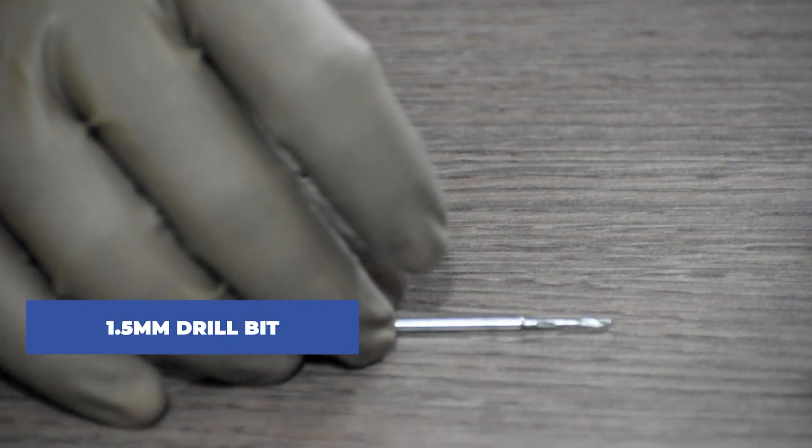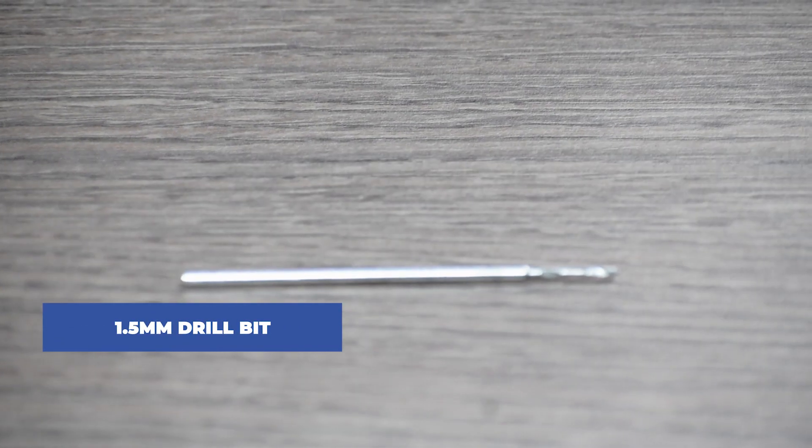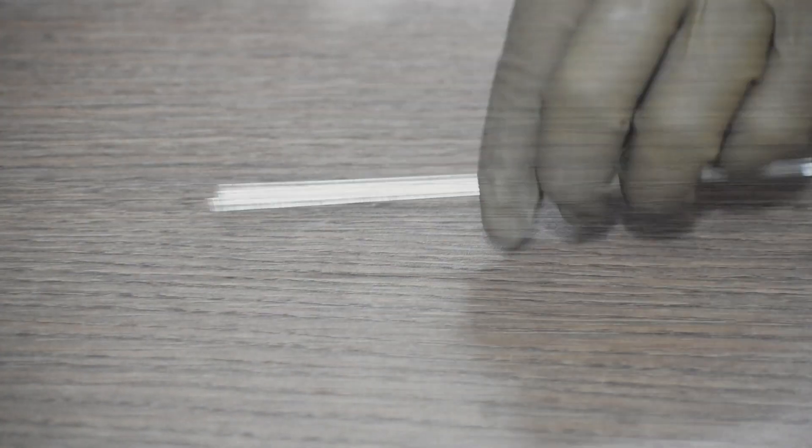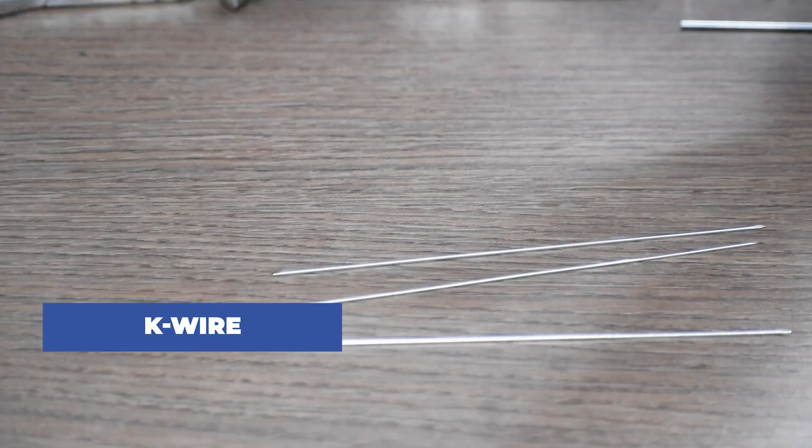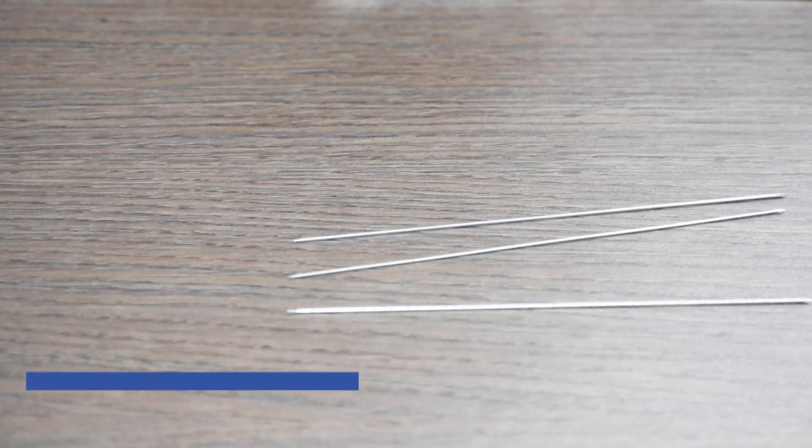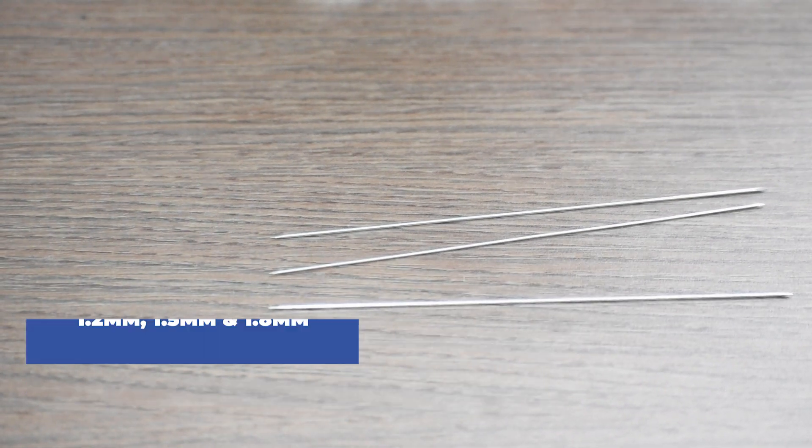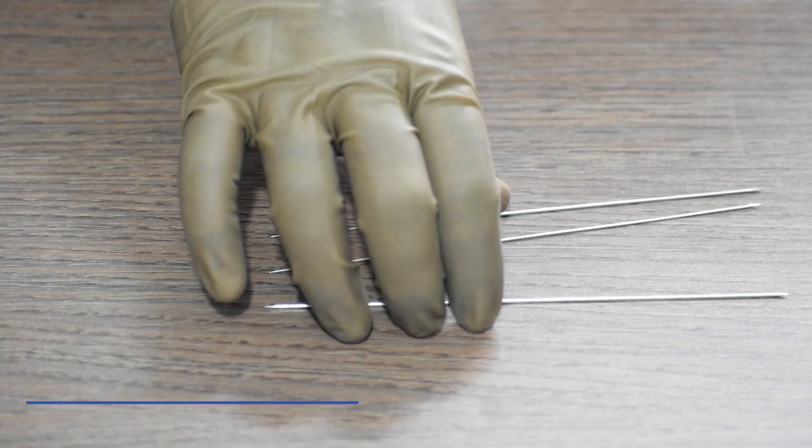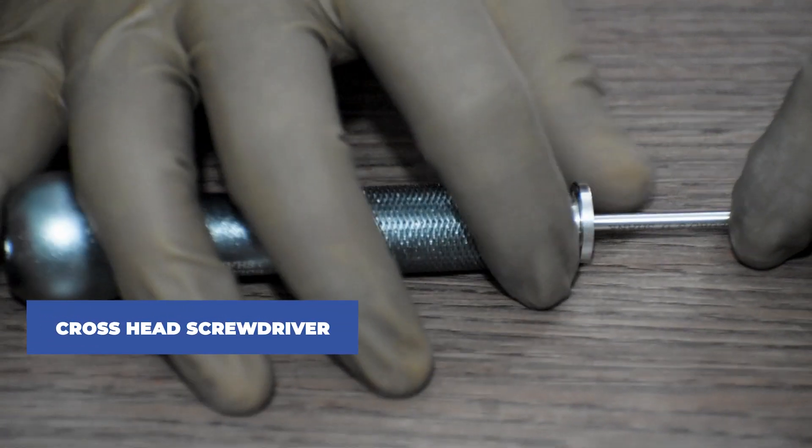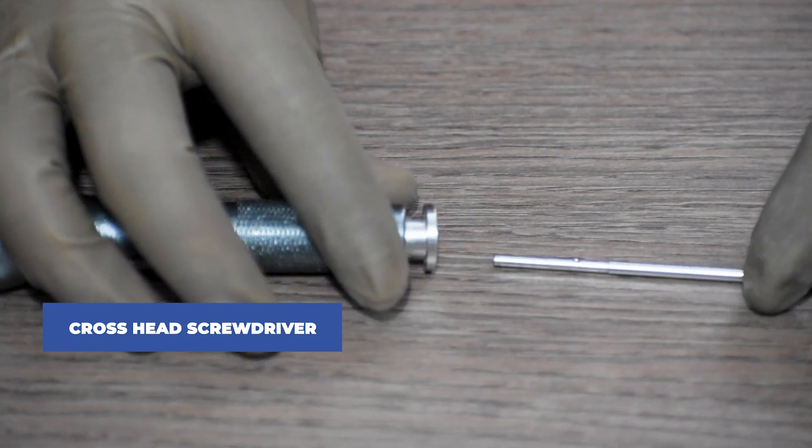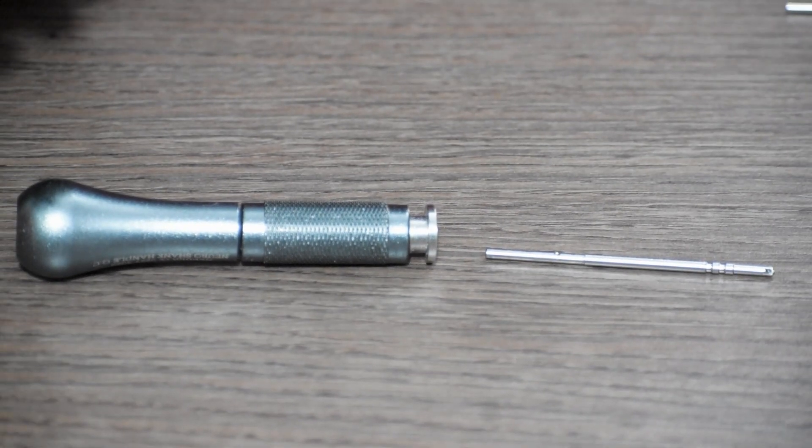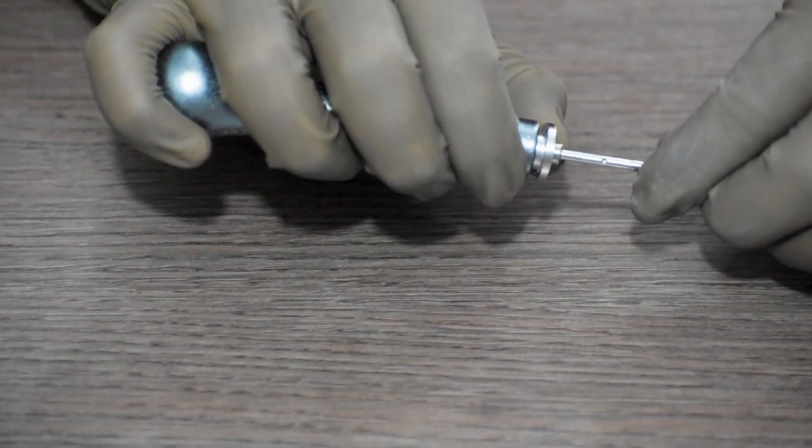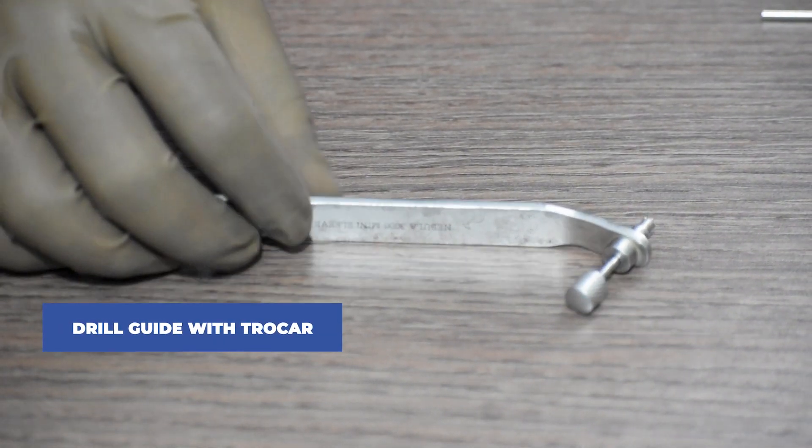1.5mm drill bit, then we will require K-wires. 1.2mm, 1.5mm, and 1.8mm K-wires are used. This is a cross head screwdriver. This is a drill guide with trocar.